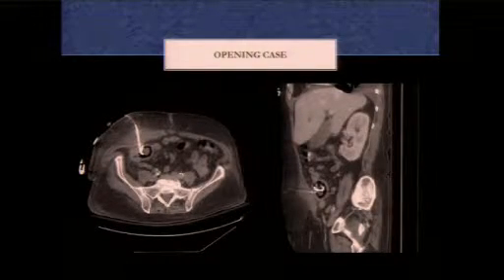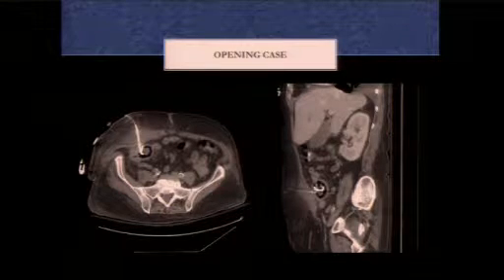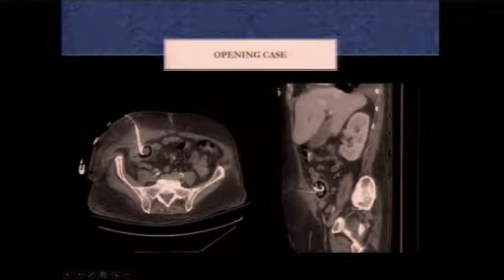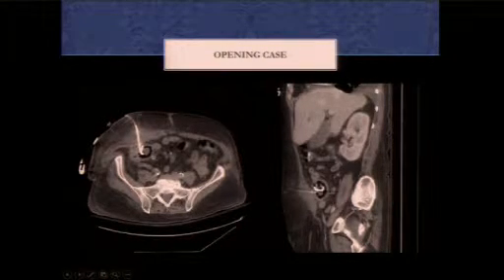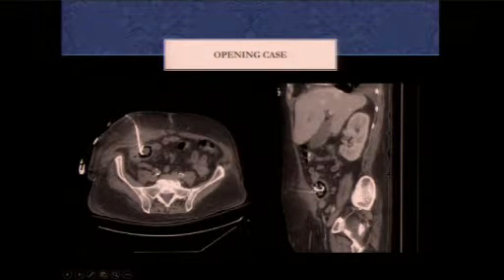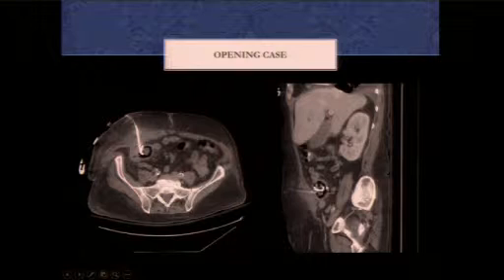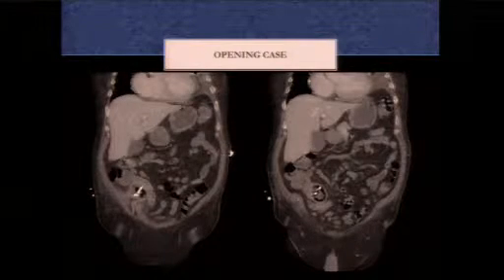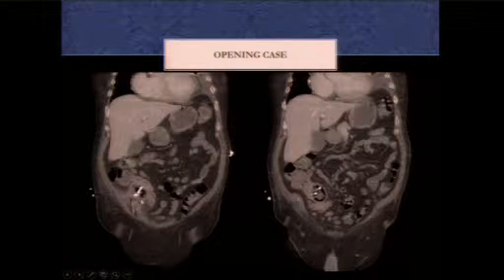So the patient came back 5 days later with feculent drainage from their drainage tube, and they wanted to know whether a fistula had developed. So we did a CT scan at that time, which showed a collection of air and stool in the right lower quadrant, in the region of where the drain tip is. You can see it both on the axial and sagittal images. And on the coronal images, it looks like the drain is still within that collection of stool and air.